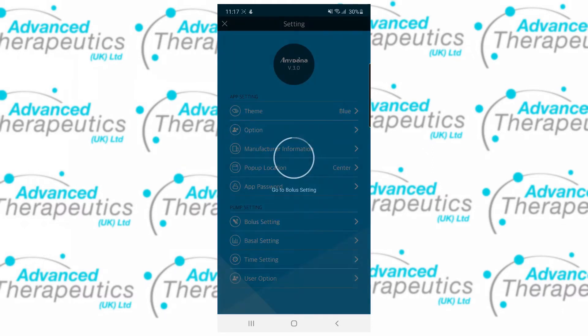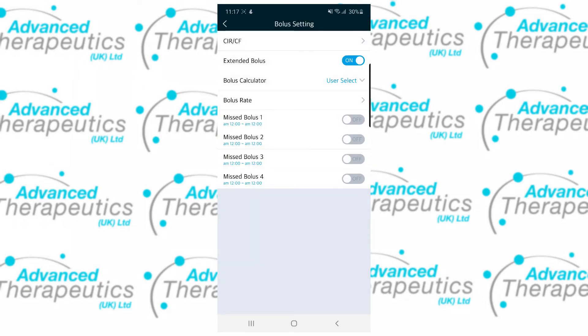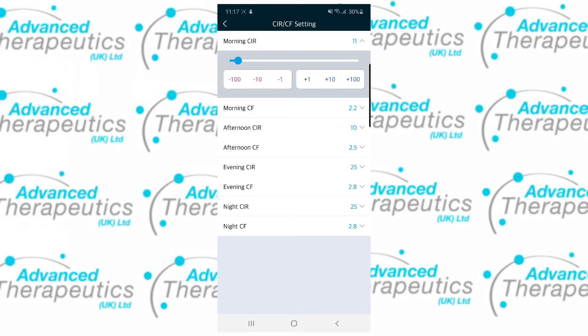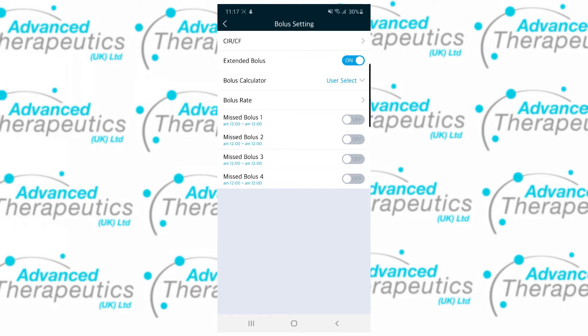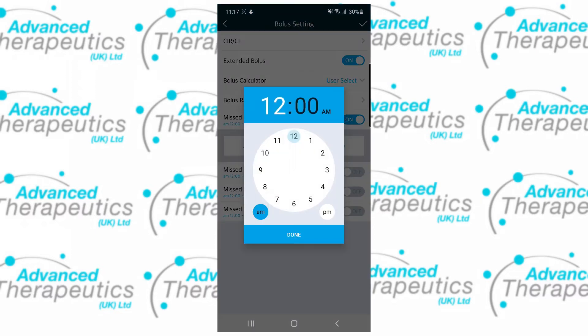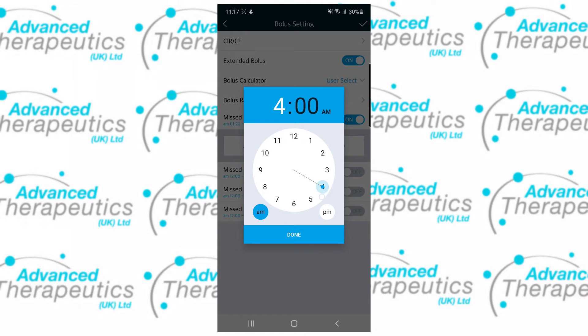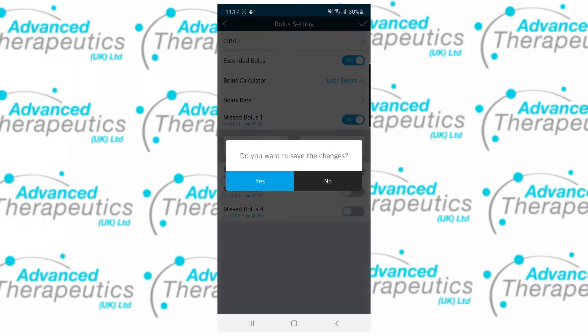In the pump settings, bolus settings will allow you to change your ratios. Tapping on the ratio will let you edit the number and when changed, a tick will appear in the top right allowing you to save. You can also set whether your extended boluses are on or off and include any missed bolus alerts that you may wish to program. Within the app, missed bolus alerts can be tailored specifically to you. Remember to tap the tick to save any changes you may have made.